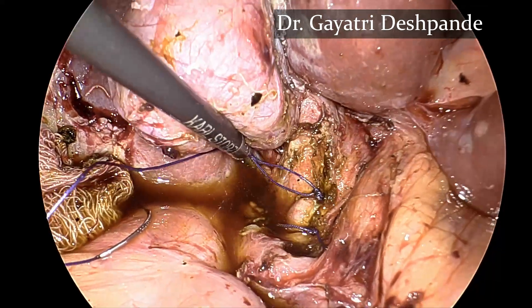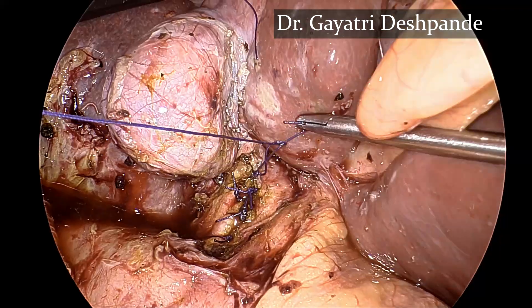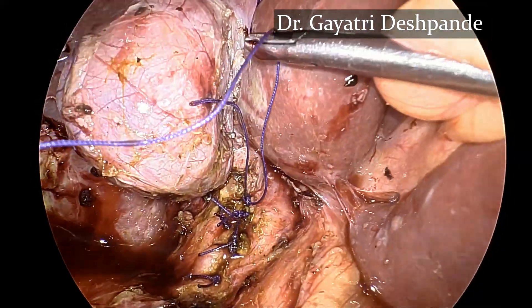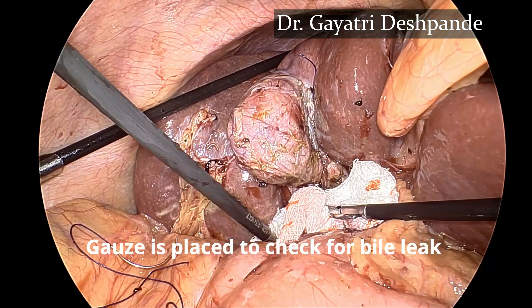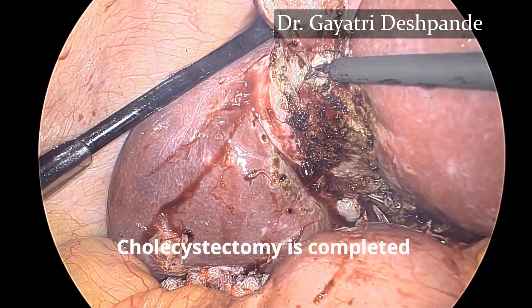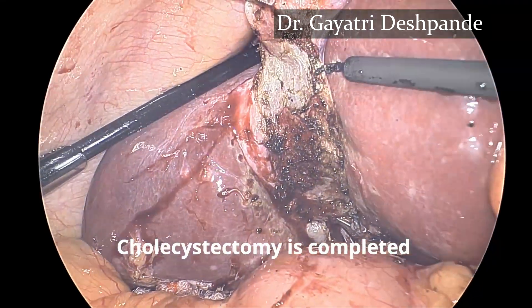The suturing has to be watertight to prevent any bile leak. After the suturing is completed, a gauze is placed to check for bile leak. The cholecystectomy is completed using hook dissection.